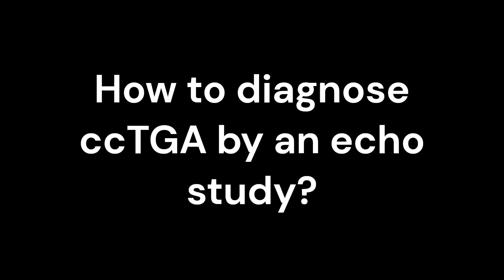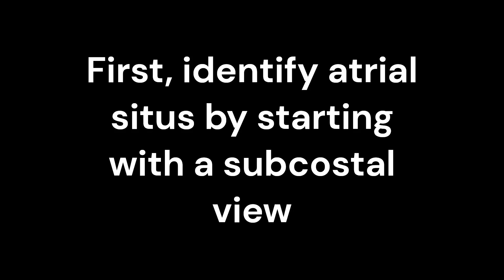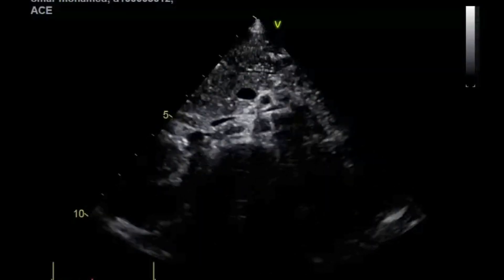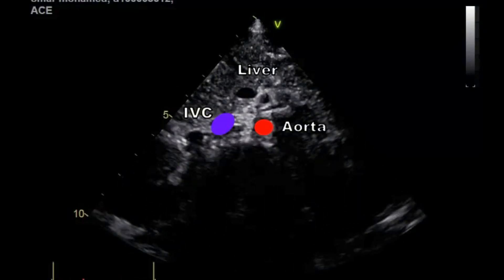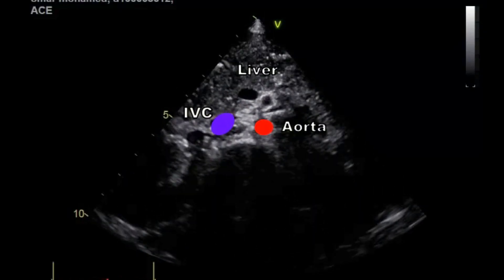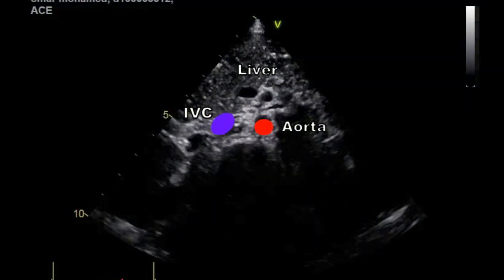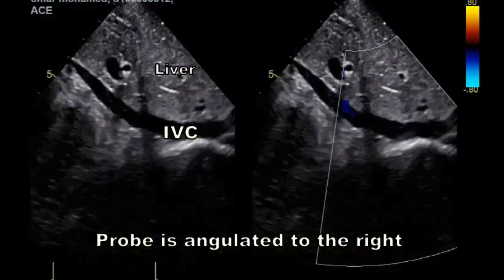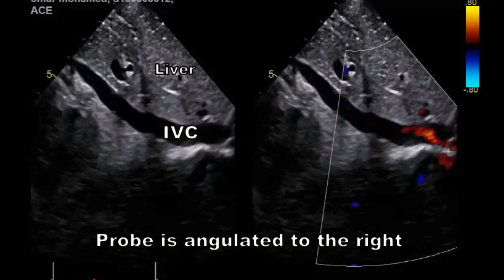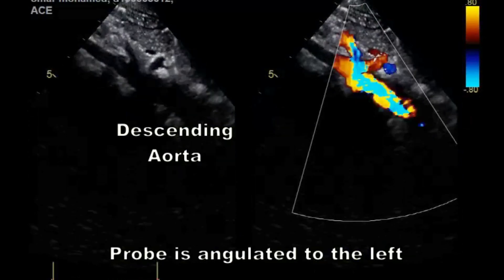How to diagnose CCTGA by an echo study. First, identify atrial situs by starting with a subcostal view. Notice that the aorta is on the left side of the spine and the IVC is on the right side. This is a normal abdominal situs, which corresponds to a normal atrial situs.